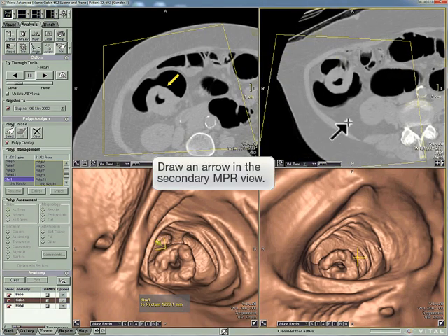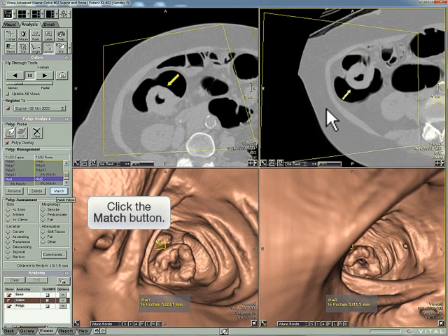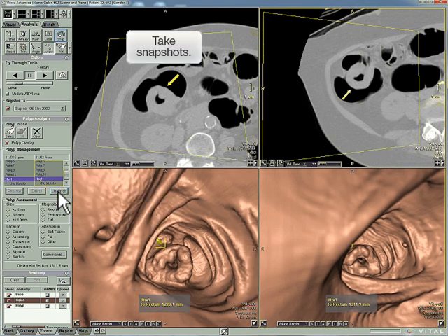Draw another arrow. Click match. Take snapshots.